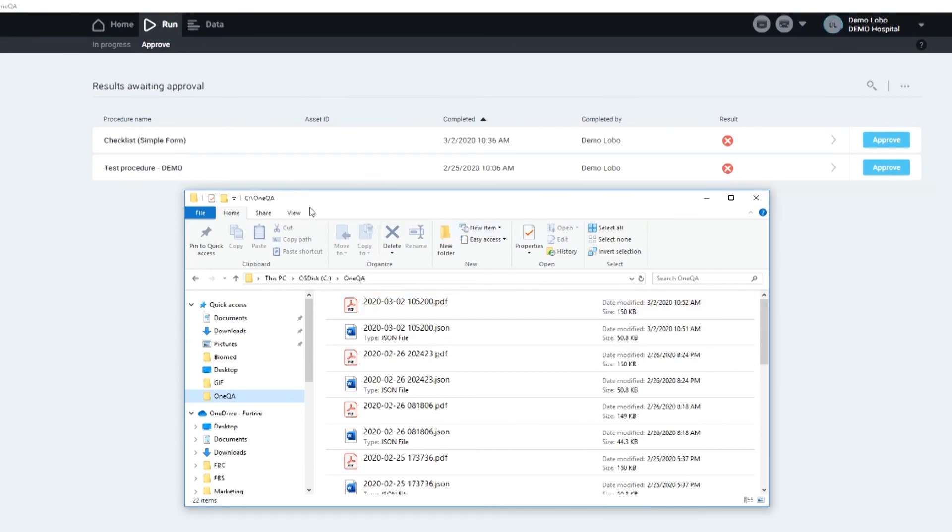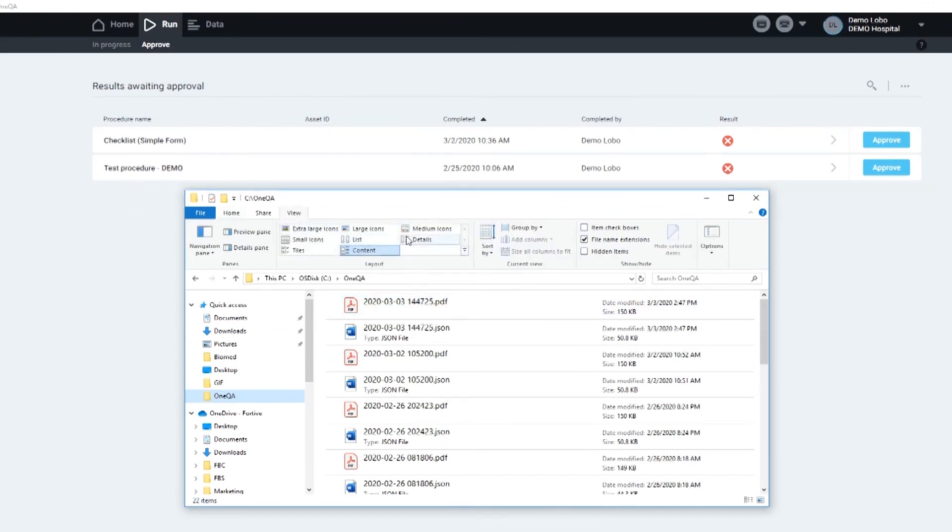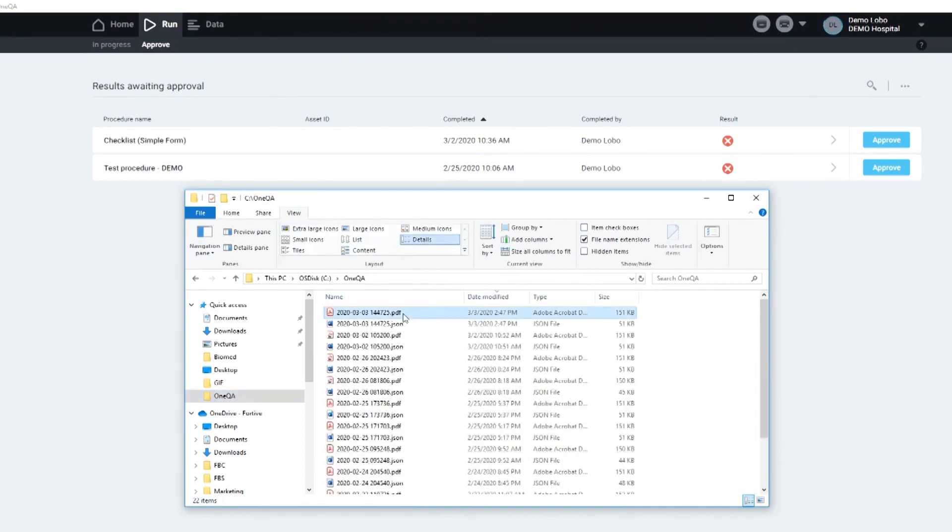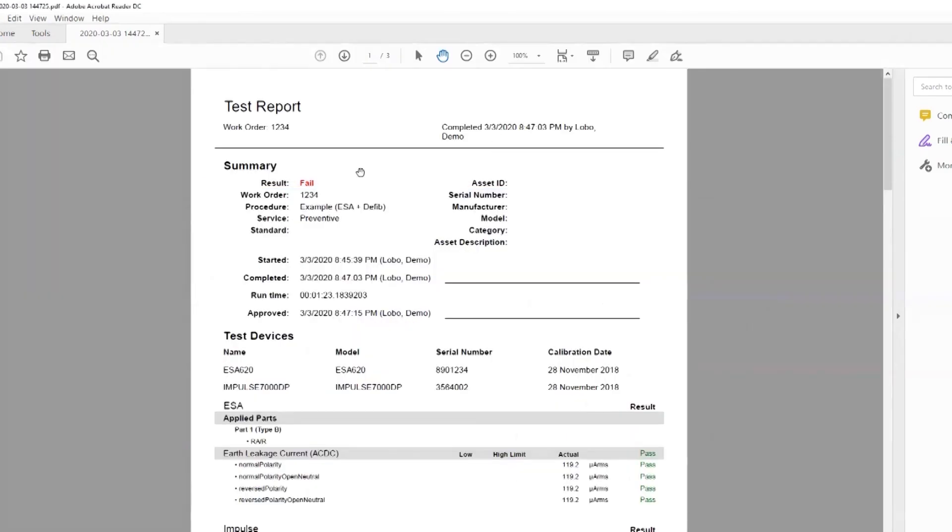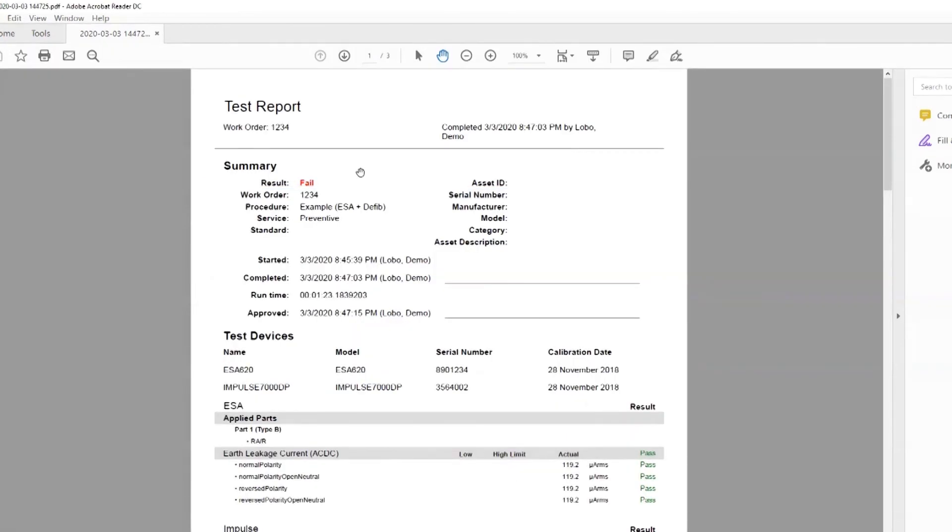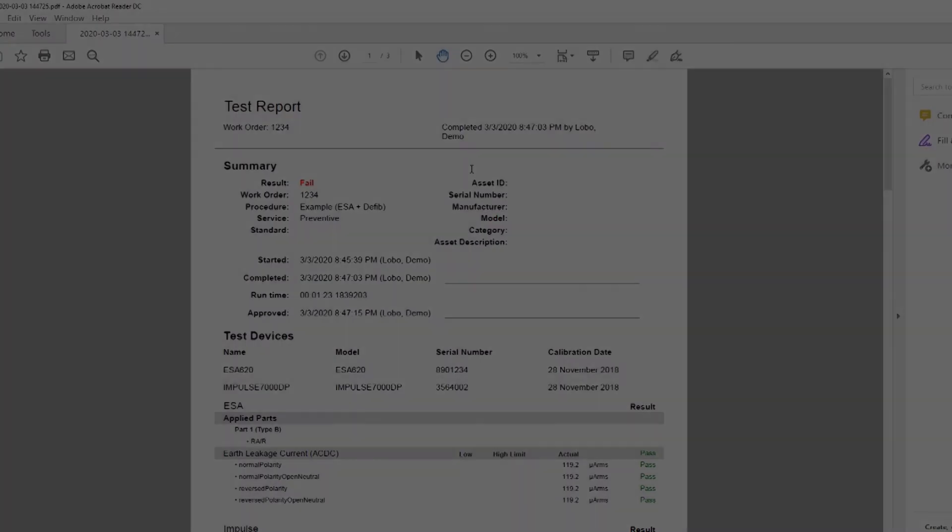So as you can see, my test results have been loaded here, 245. Here is the report we just completed. It was a fail, and I completed it today. Thank you. This is how you can run a procedure on OneQA.